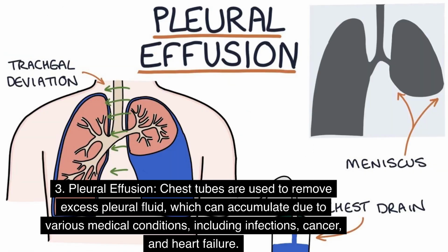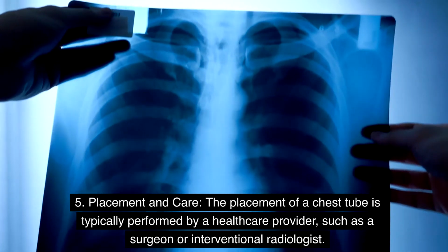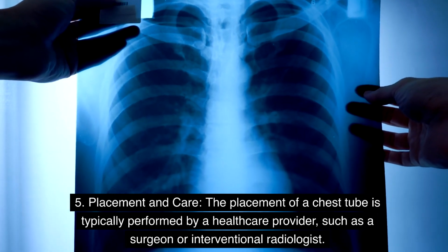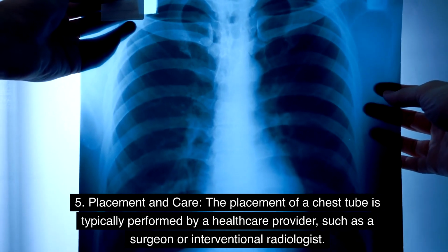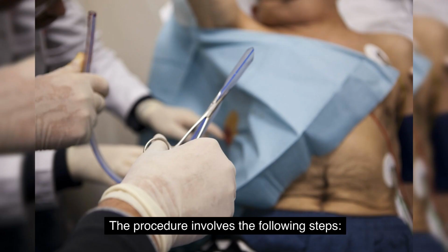3. Pleural effusion. Chest tubes are used to remove excess pleural fluid, which can accumulate due to various medical conditions, including infections, cancer, and heart failure. 4. Postoperative care. After certain chest or lung surgeries, a chest tube may be placed to drain air or fluid that can accumulate in the pleural space. 5. Placement and care. The placement of a chest tube is typically performed by a healthcare provider, such as a surgeon or interventional radiologist. The procedure involves the following steps.